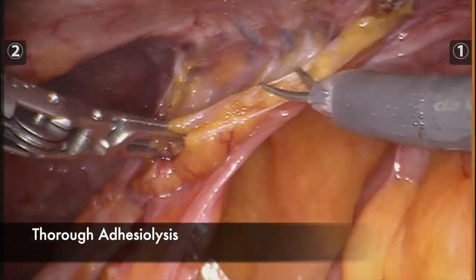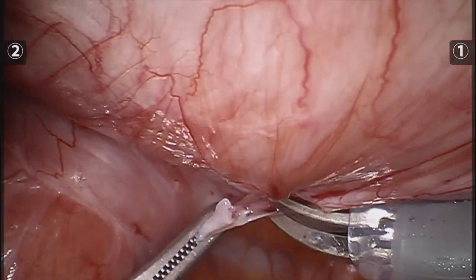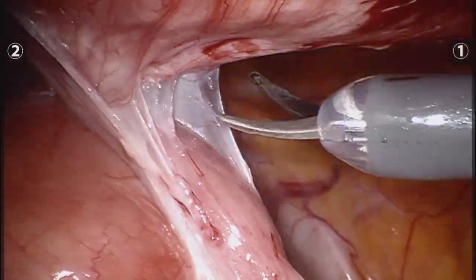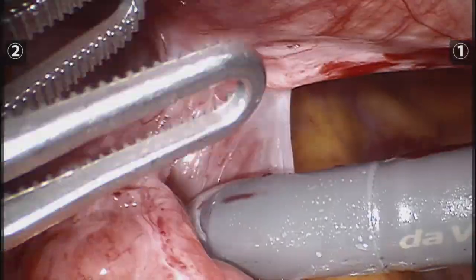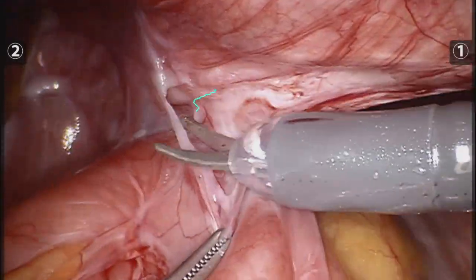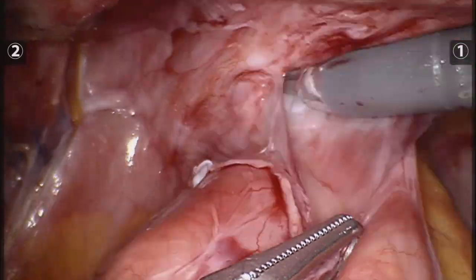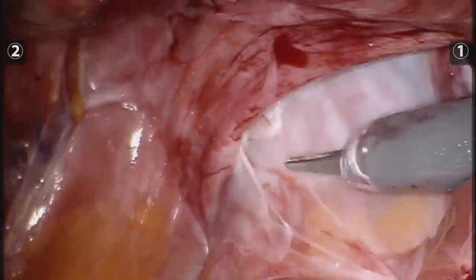Surgery started fairly doable with an important amount of adhesions, but all of them were very loose and allowed for dissection. As many professors point out during their surgeries, I tried to grasp the adhesions and the fibrotic tissue around the bowel and not the bowel itself to prevent injuries.